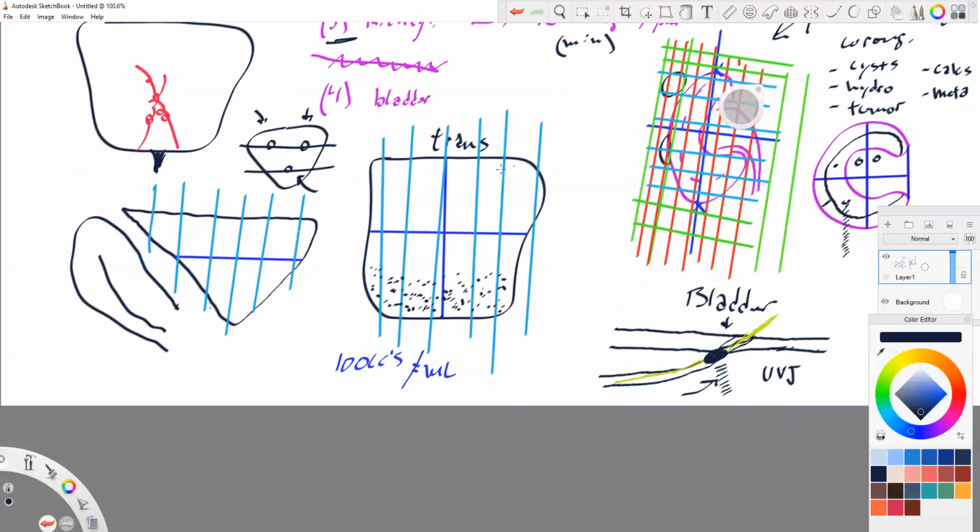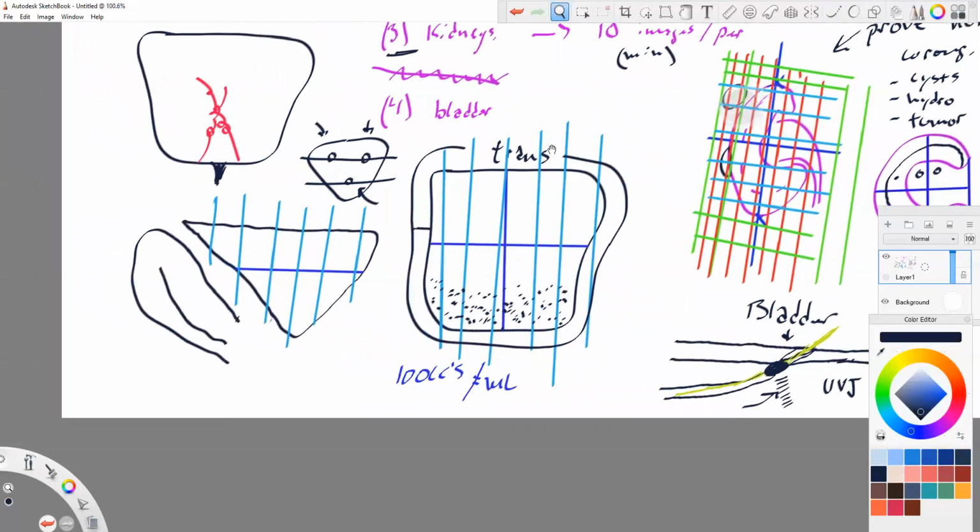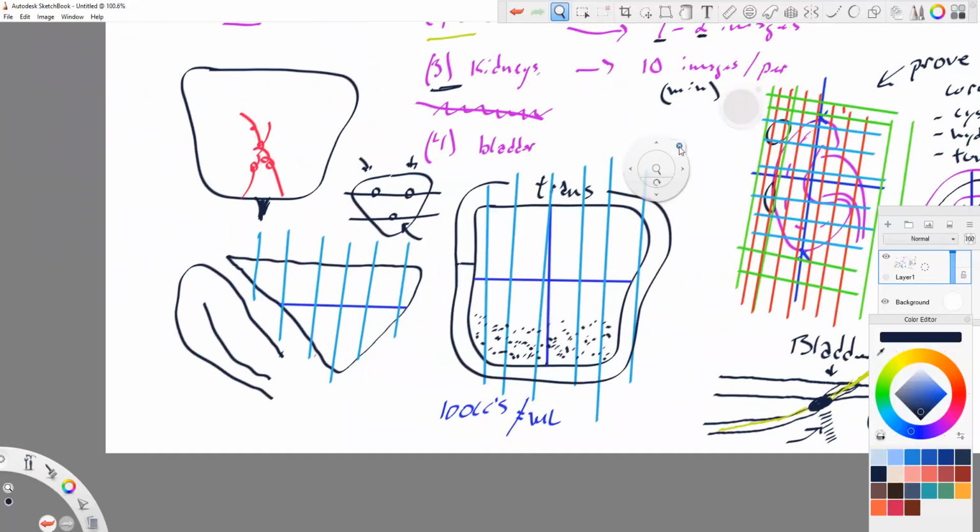If the wall of the bladder is extraordinarily thick, we are going to take a look at that, and we'll probably measure the wall. Normally, I wouldn't suggest measuring the wall every time, but if it looks thick, go ahead and measure it. And Doppler it. Throw Doppler on there and see if it lights up like a Christmas tree, then that's probably cystitis. Isn't that weird? It's called cystitis rather than just call it bladderitis.